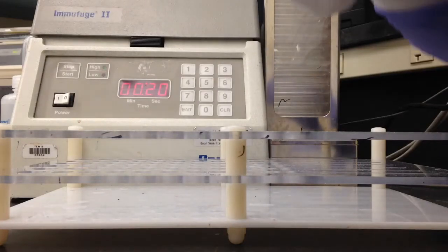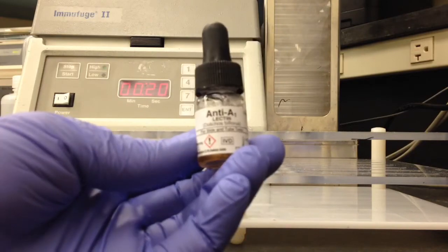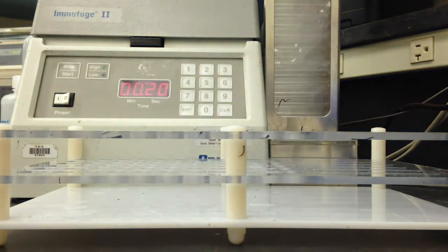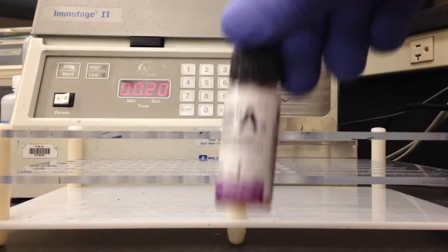In this video I'm going to show you how to test for subgroups of A. To do this you're going to use A1 lectin, which will agglutinate A1 red blood cells.